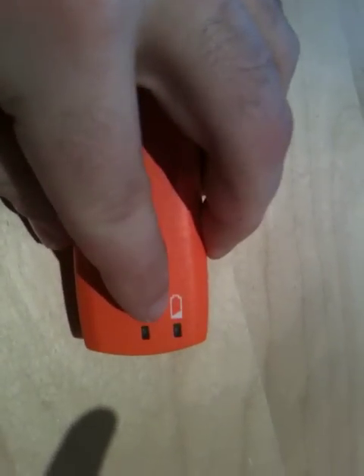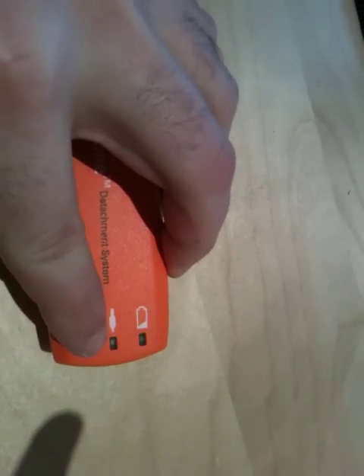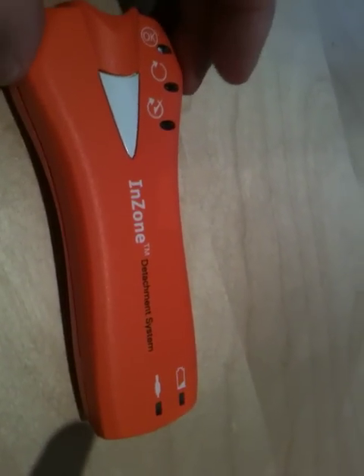Pretty simple stuff. It's a single-use device. There's a battery warning light and a light telling you you've got a good connection if you've got a second coil or second electrode connected. So what does it look like inside?